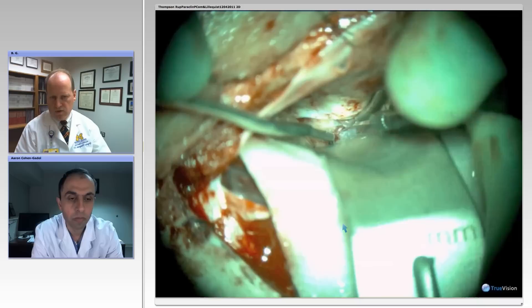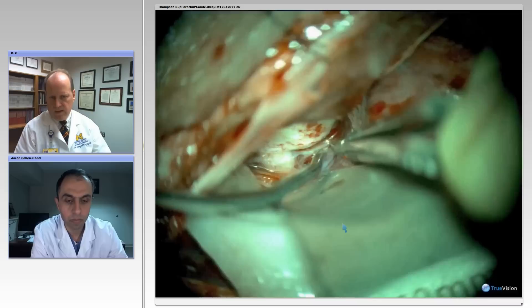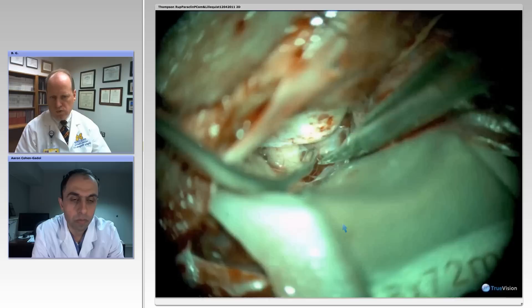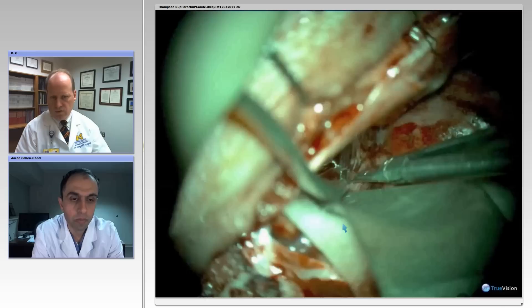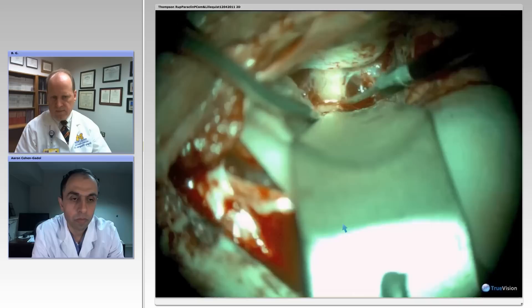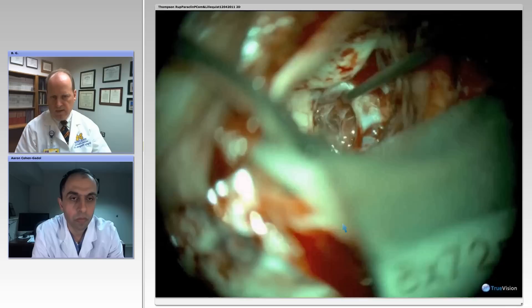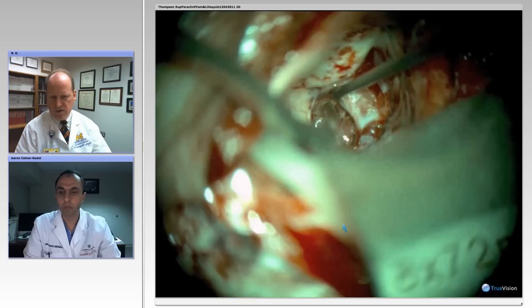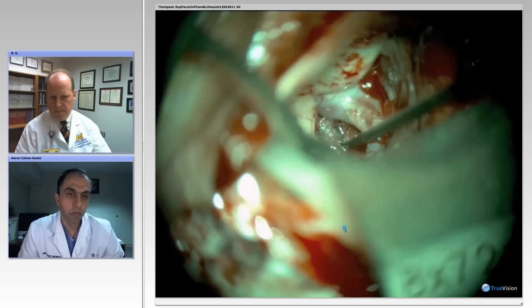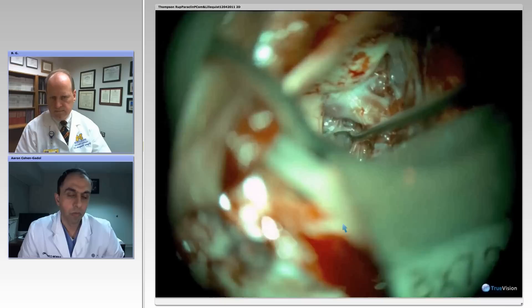The thing that I think is notable about this case and a good starting point is that you will see as the dissection goes that the proximal neck of the aneurysm is actually under the clinoid and not accessible via the usual approach. And so here we are opening up over the internal carotid, just medial to the carotid and lateral to the optic nerve. And then looking a little bit more distally now, I open the fissure just to relax — give a little bit of relaxation between the optic and carotid as well as the frontal and temporal lobe. And I try and get a medial view to see the perforators off the PComA, looking between the optic nerve and the internal carotid.